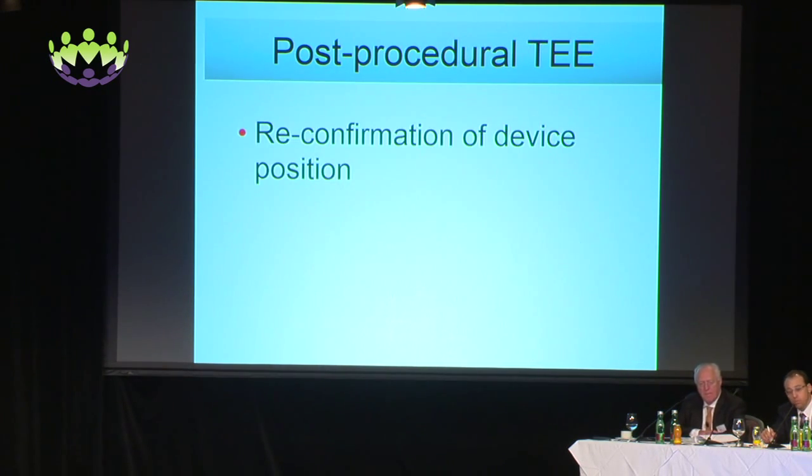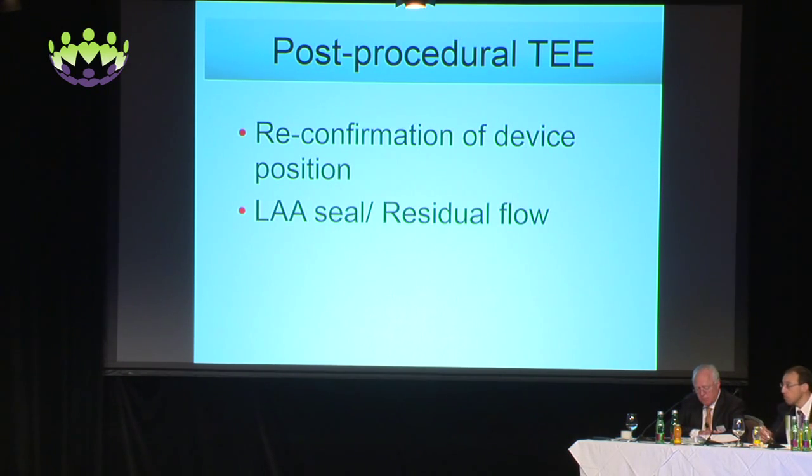So very shortly, what do we have to do after the procedure? So we have to reconfirm the position of the device. We have to recheck if there is complete LAA seal.